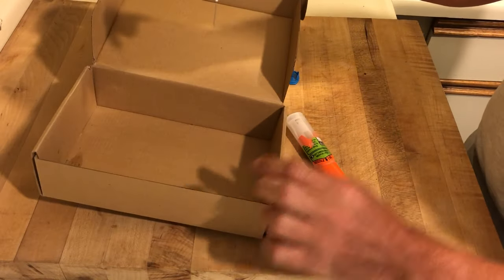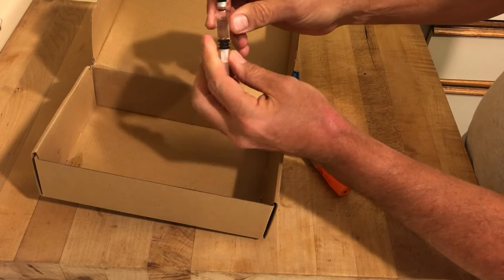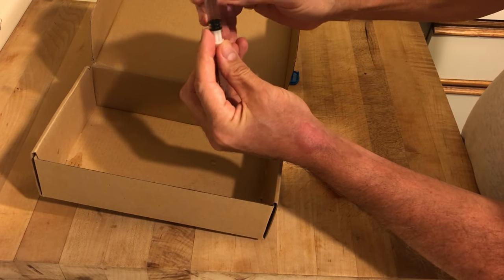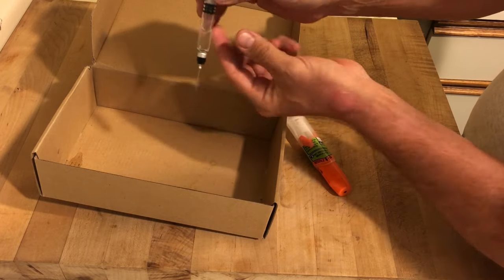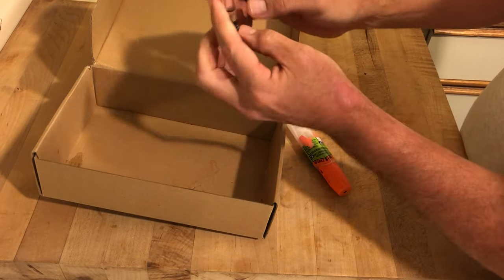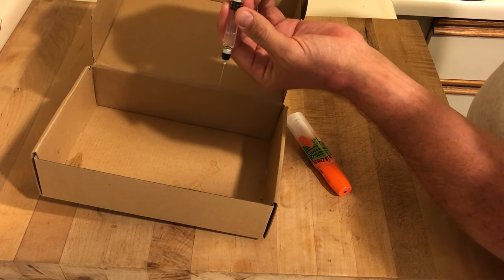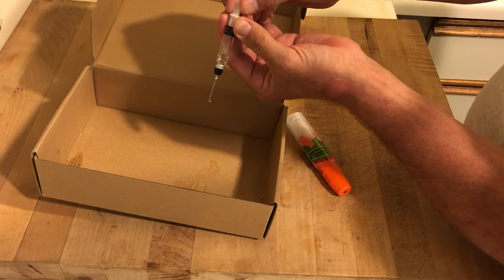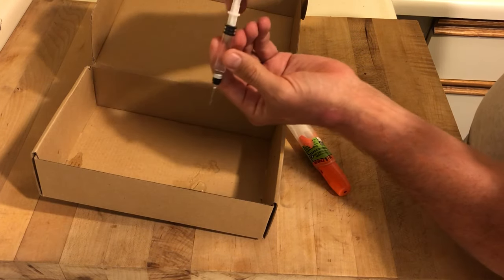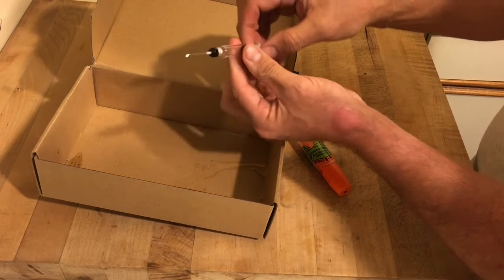Let's get our patient back and give another dose of Epi. Turn it upright again, suck in more air, turn it back to the patient, and you can give another dose. That's three. Take it back — that's four. And finally, that's five. There are five full doses of Epi in one single EpiPen. That's pretty amazing.